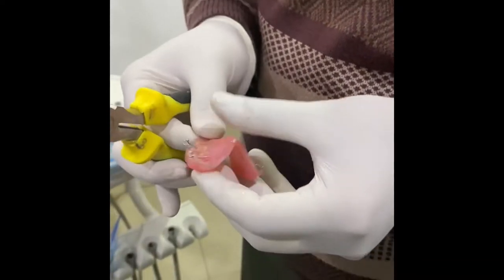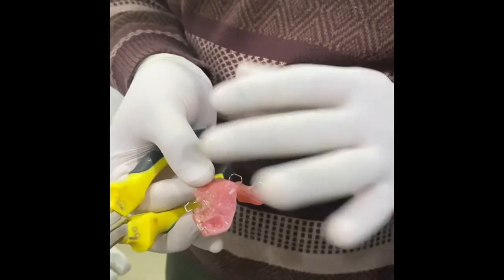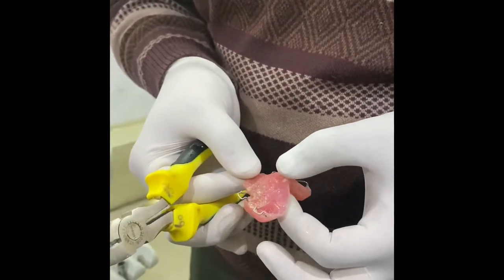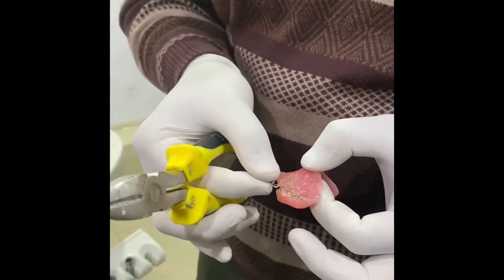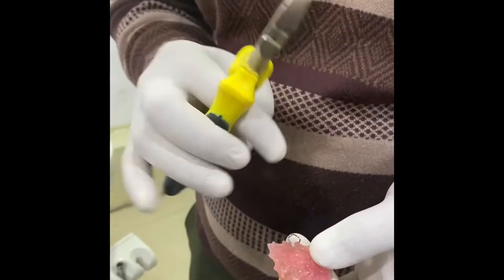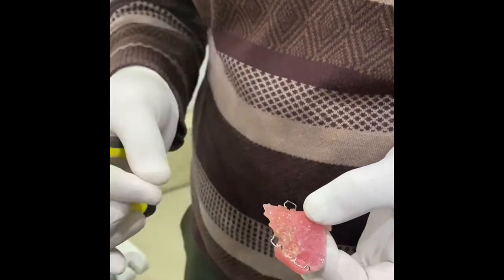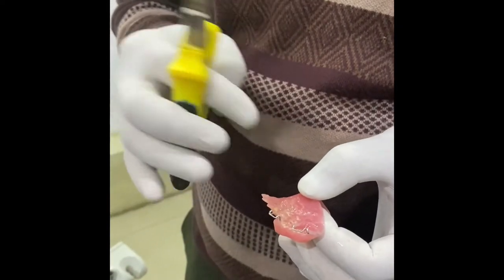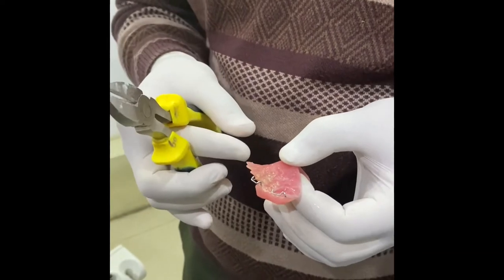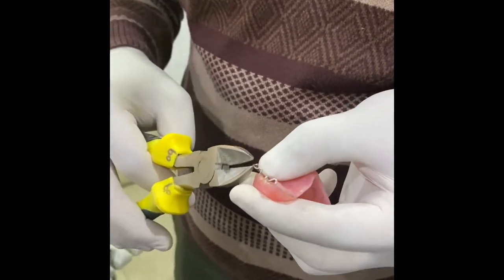In this video we are discussing a patient who has completed twin block treatment and is now progressing to bonding of the upper arch. With the bonding of the upper arch, the Adams clasp is not suitable because it will interfere with the brackets and the tube. So we need to convert the Adams clasp into a ball-ended clasp while using the twin block along with fixed appliances having the brackets in situ. The method of conversion is as follows.